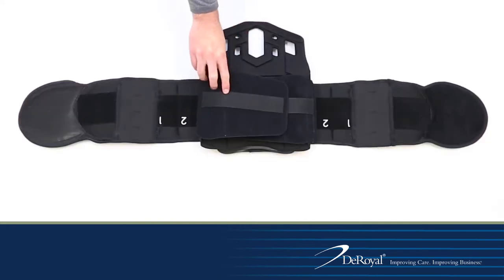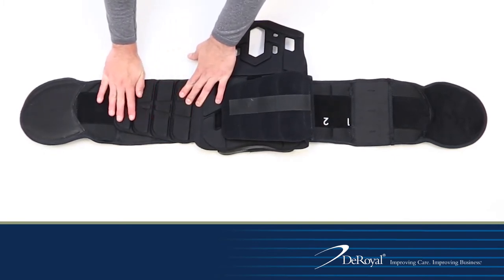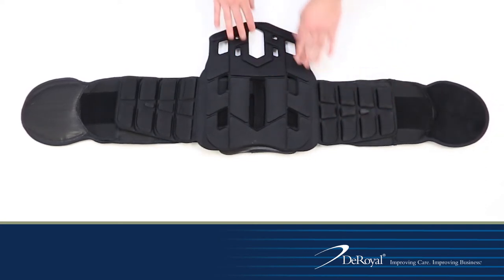Reattach the back flap hook closure at the top of the back panel and press firmly along the securement strip. If the brace comes configured with lateral panels, reinstall them by securing the integrated hook strip to the side flap of the soft goods. Anchor the lateral panel using the hook strip on the back of the lateral panel to the loop strip on the interior part of the belt.